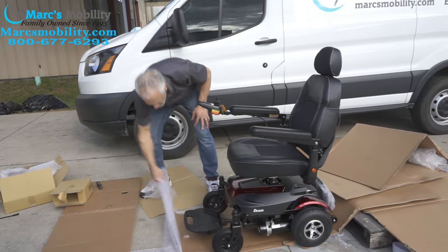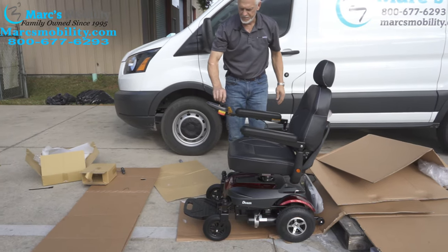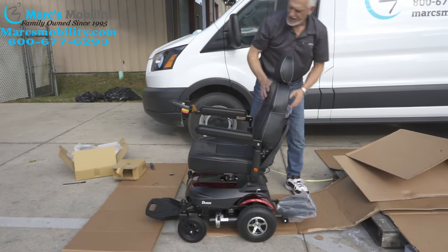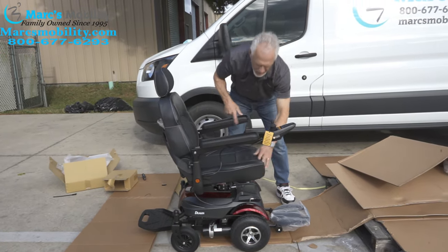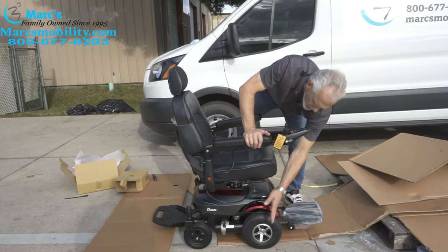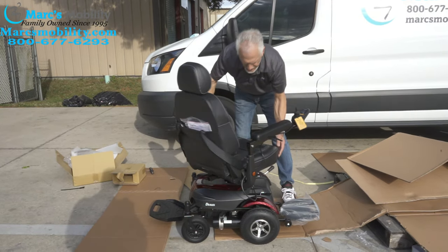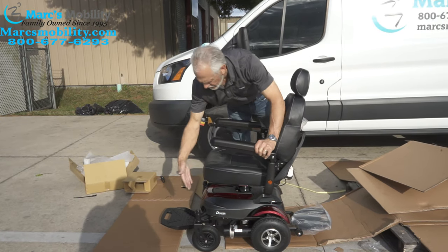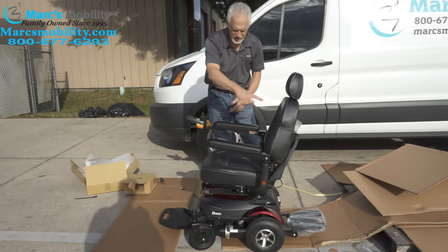That noise you hear is this garbage over here. You have a rear foot plate, and if you swivel the seat all the way around, now you'll be driving the opposite direction — it becomes front-wheel drive instead of rear-wheel drive. And if you bring the seat back this way, now you've got rear-wheel drive with the front wheels in front. The electronics will switch over when you switch the seat around.